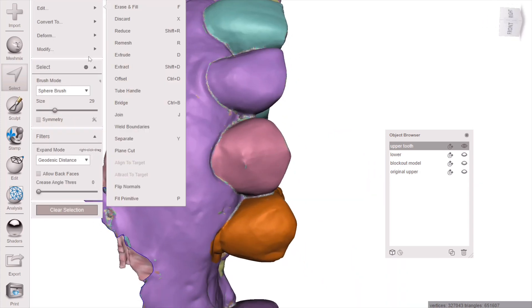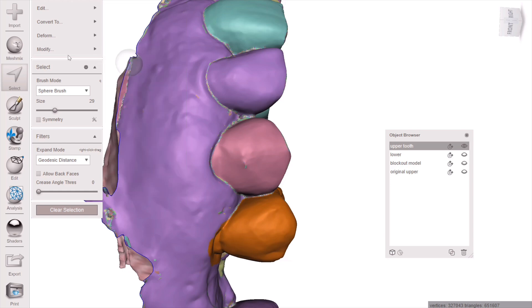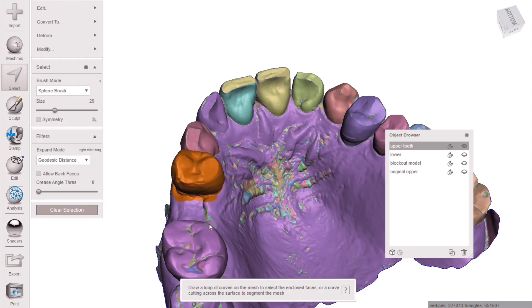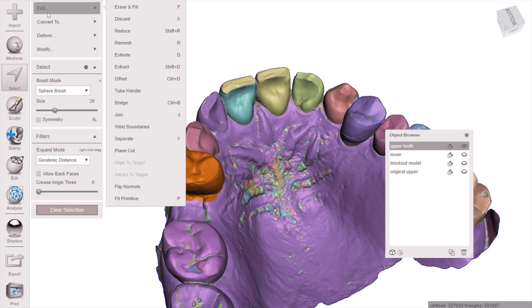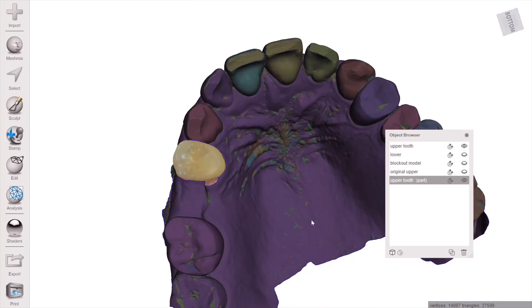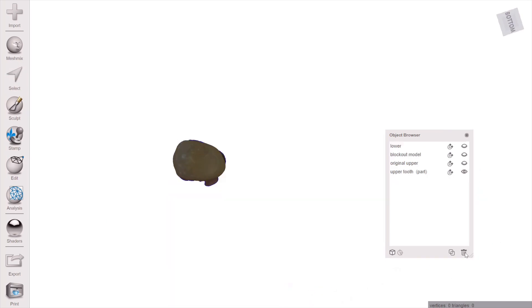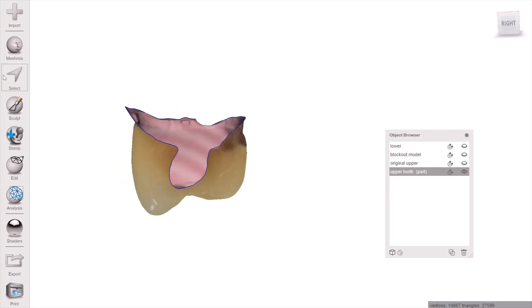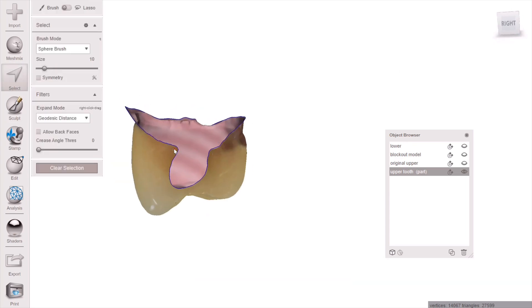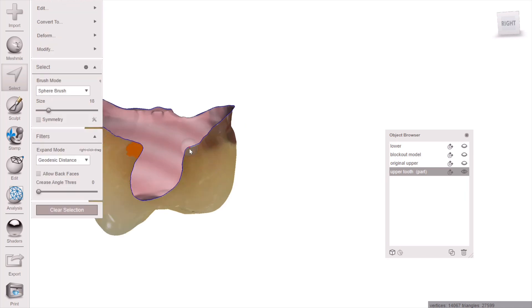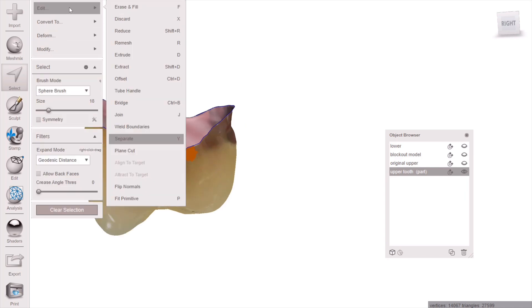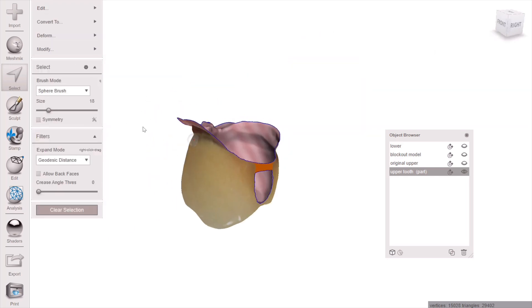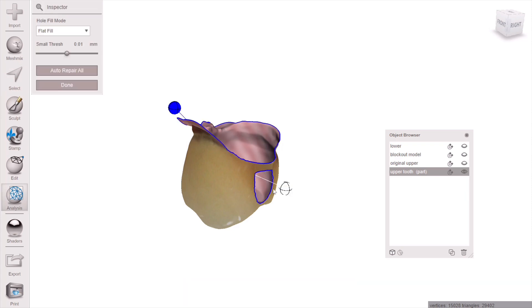If you have issues separating it out, go to Modify > Expand Border or Expand Group and you'll close some holes. Then hit B on your keyboard for smooth border, then hit Y on your keyboard — or Separate — to make it its own mesh. Now go ahead and close the little hole here by selecting just these corners and nothing else, and go to Edit > Bridge.